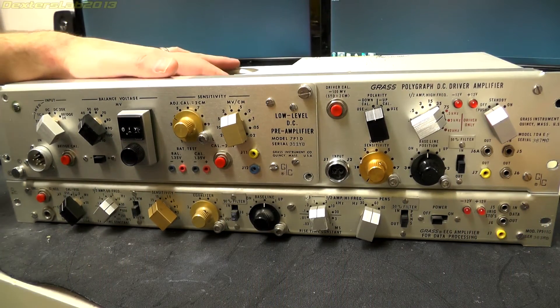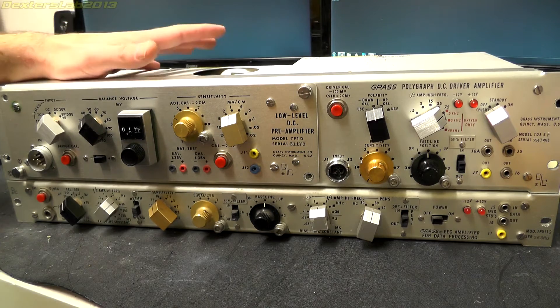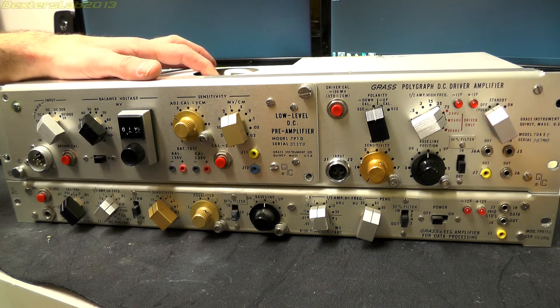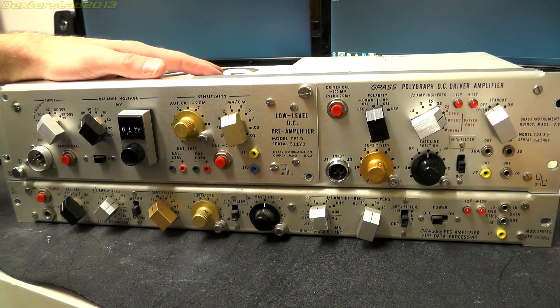Hey everyone. What we have here is a couple more modules from the Grass polygraph system that I've been slowly taking apart and scrapping. These are probably going to be the last two modules I'll be looking at — we've covered pretty much everything. I will be looking at the pens and the mechanical drivers for the chart recorder, hopefully sometime next week. At the same time I'm going to take my variac over to where the polygraph is stored and try powering it up gently to see if we can get anything out of it. That would be nice because some of these controls might become clearer when we can actually turn it on.